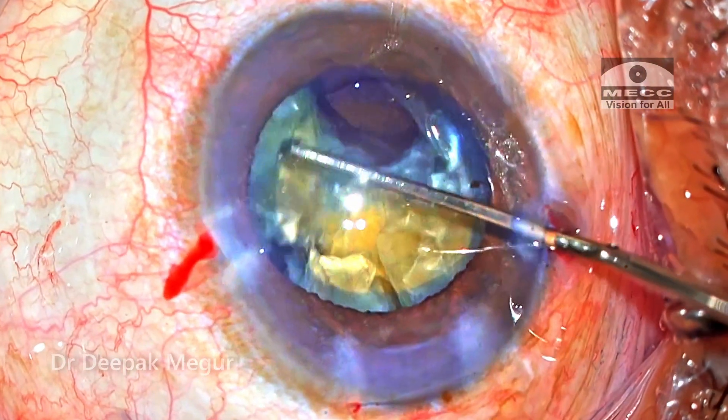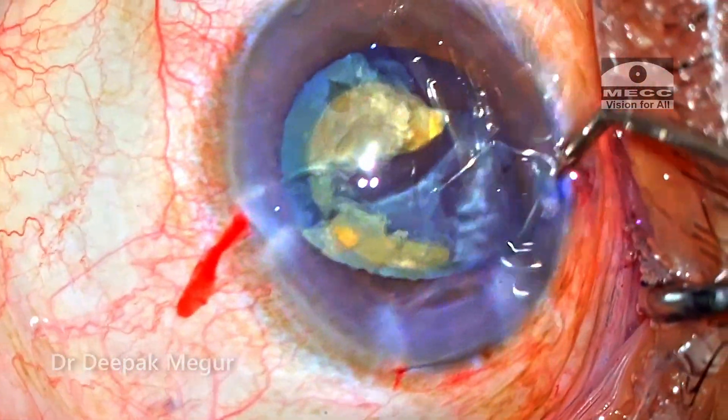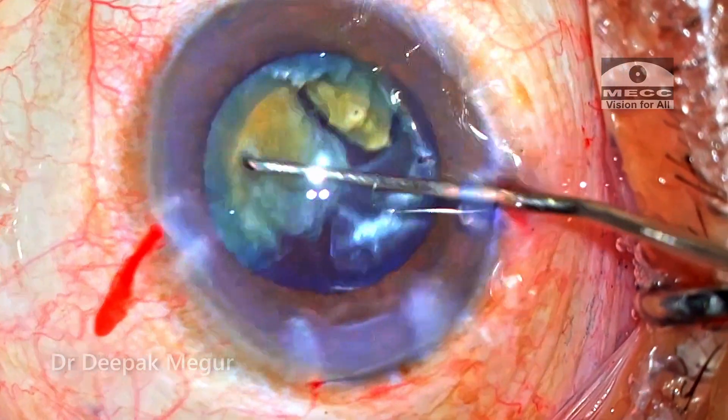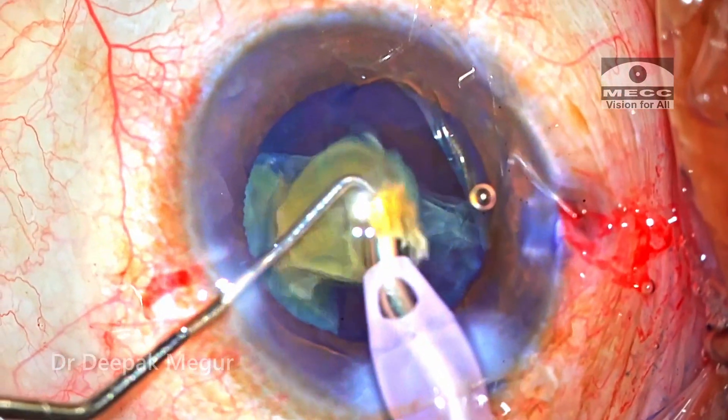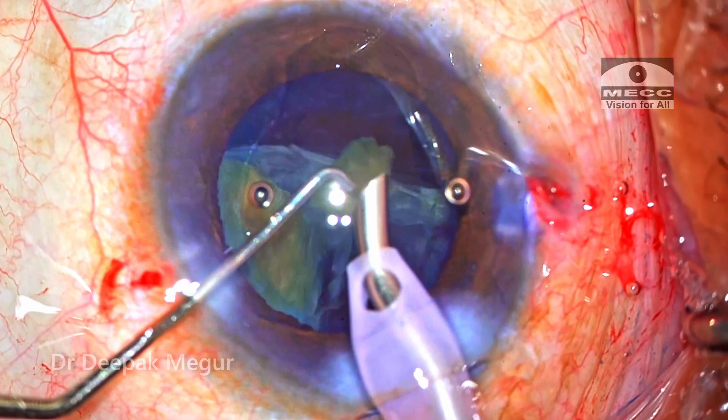At this point I realized that something could be amiss, but still not very conclusive. There are three more fragments to be emulsified. The first fragment is emulsified. The other two fragments are somehow hidden.